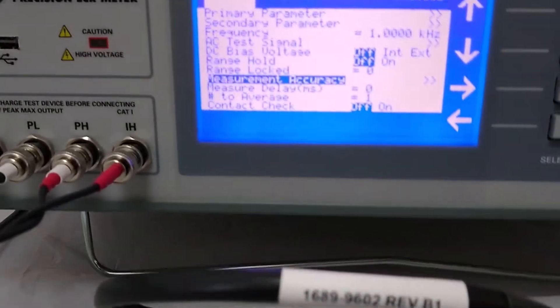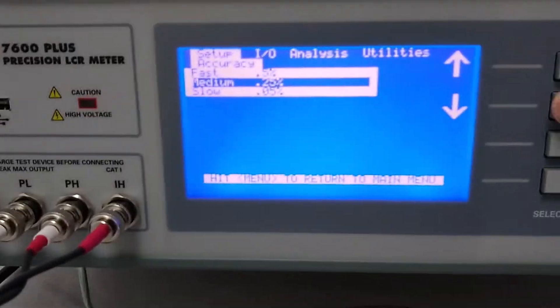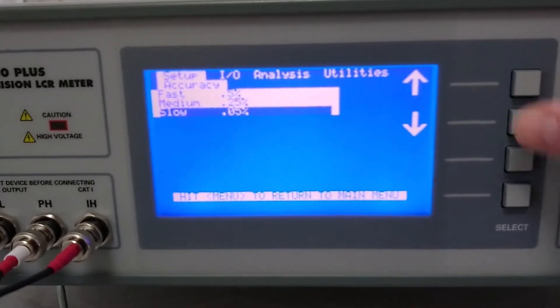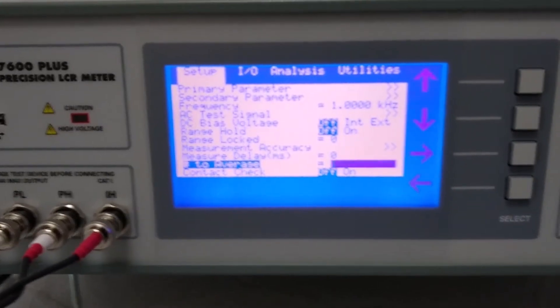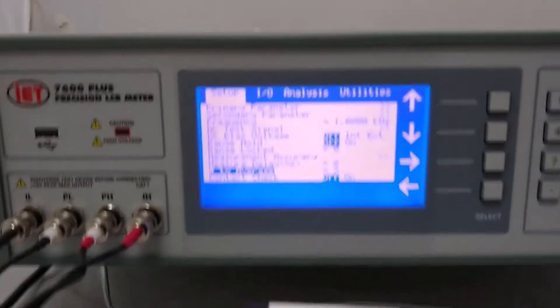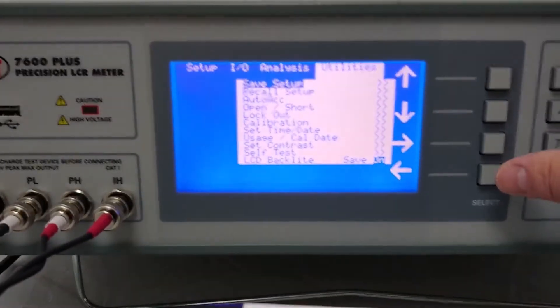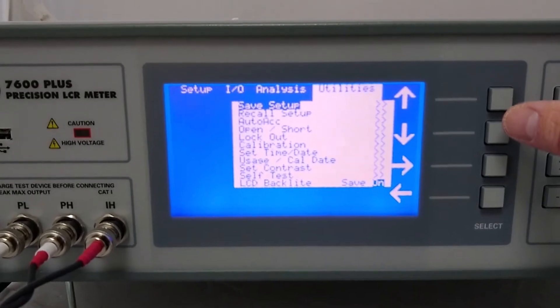We should go down to measurement accuracy. Again, press enter. Use the arrow keys to go down to slow. And we can also add an average. So let's enter an average of 3. If we'd like at this point, we could actually go over to utilities and go to save setup and save setup as default.